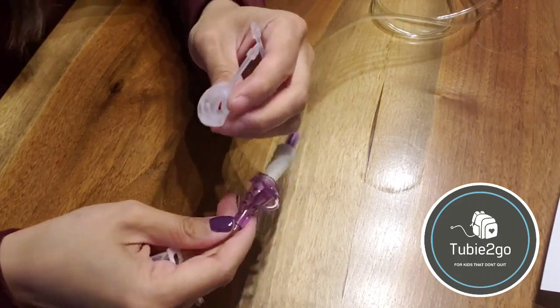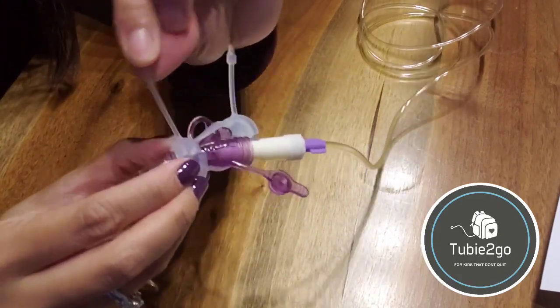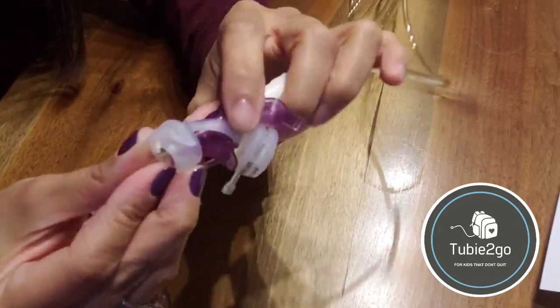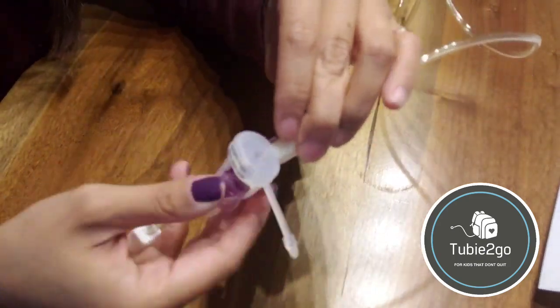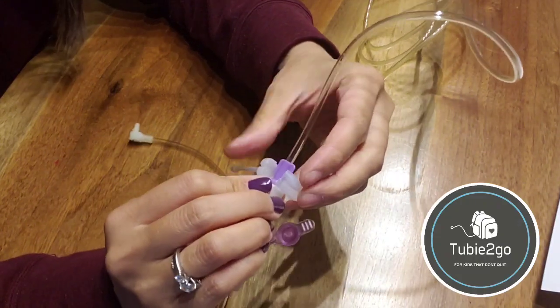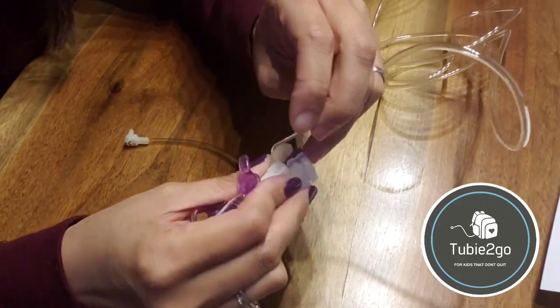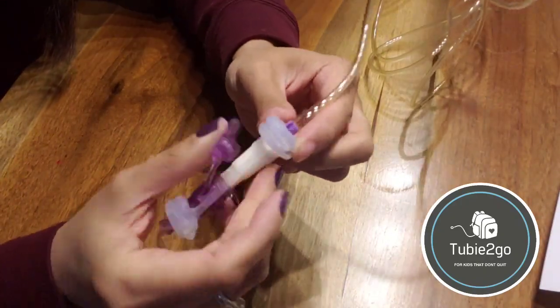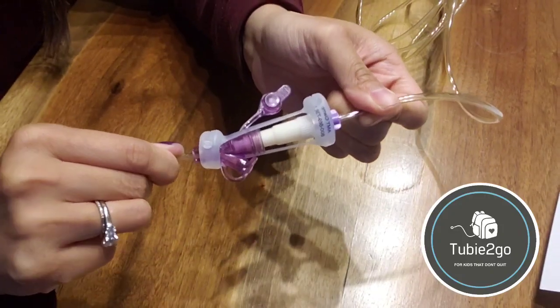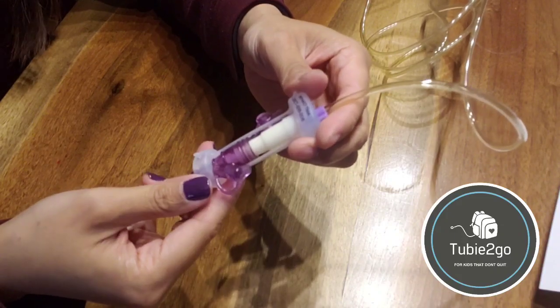You take the little end and put it at the bottom of your extension. You secure it by wrapping this silicone fastener into a little groove that exists on the AMT clamp, and it just sits into the groove and secures itself. And then you stretch the other end all the way to the feed bag tip. That large end is going to wrap around just past the white tip of your Christmas tree. Again, you take this silicone piece, wrap it around, and let it sit in the groove where it's going to be secured. And now your two ports are connected and secured from being disconnected through tugging or rubbing against other material that might cause it to disconnect.